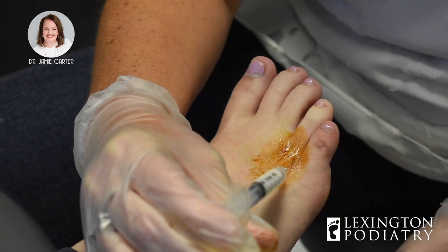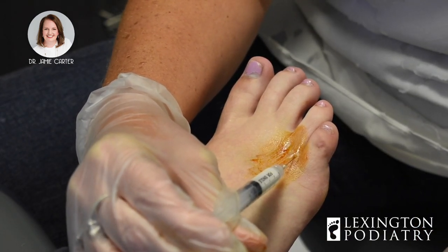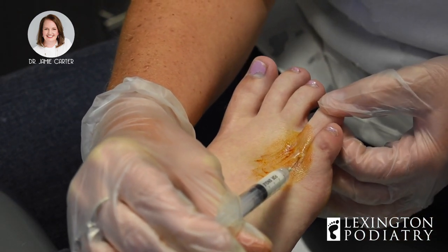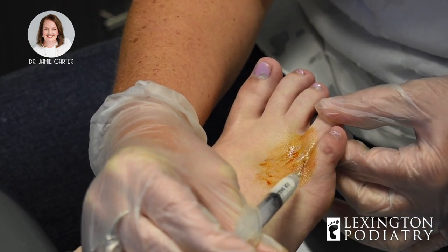It's important to inject the fluid very slowly — it will cause the joint to distend, and that can be pretty painful. The patient will normally feel a lot of pressure in the area because it's a tight little space in there. You'll also usually see the toe move or stiffen up, like hers has done.